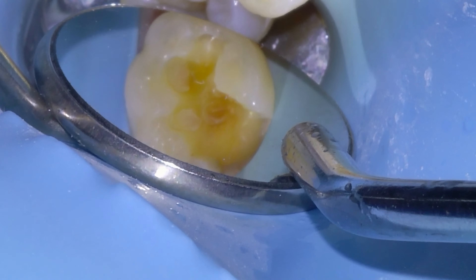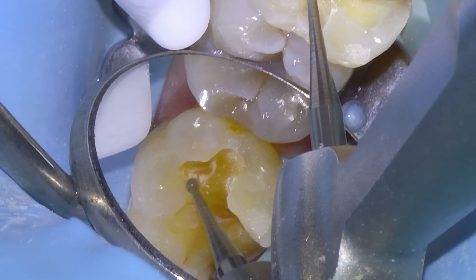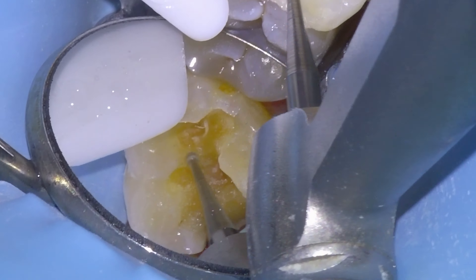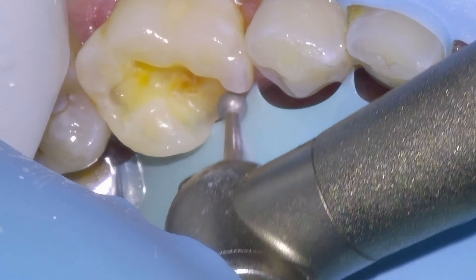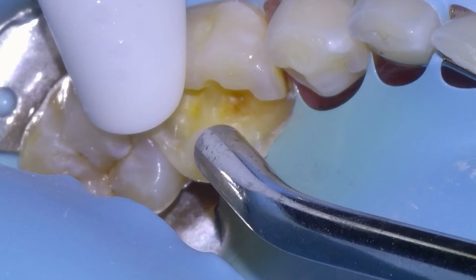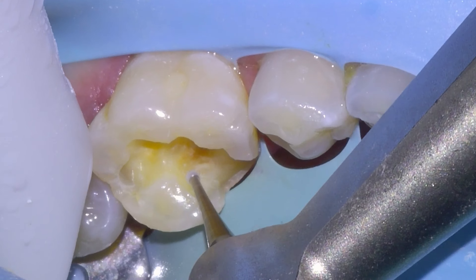I'm going to check with the mirror and we can see there are a couple more spots of old filling to remove with a slow-speed carbide bur — getting that patch in the back and then the other patch here. That one just jumps right out. So we have most of the old filling out, and we're just going to round off any sharp internal edges on the inside surface of the prep, make it nice and smooth, then check that all the composite has been removed. One more little spot to drill out — that jumps right out — and now we're ready.